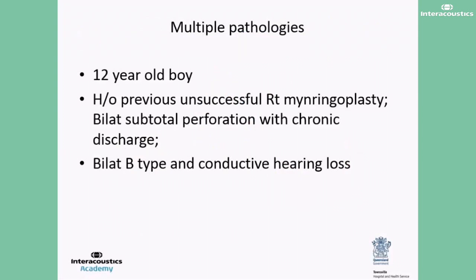Wideband absorbance is very useful in assessing middle ear function of ears with perforation. Tympanograms usually reveal a B-type tympanogram with a large cavity volume in ears with tympanic membrane perforation. However, it does not determine the function of the structures behind the perforated eardrum.